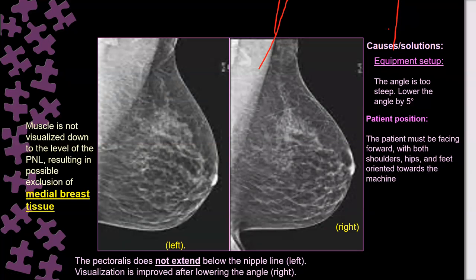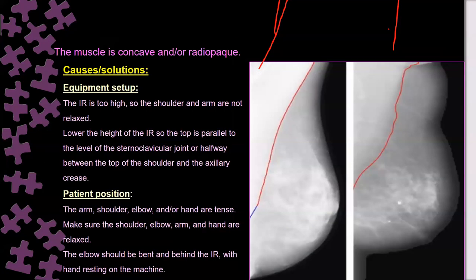Certain position of the patients, as well as the angle of the machines. We'll see. We'll talk about the angles, inshallah, in the next slides.